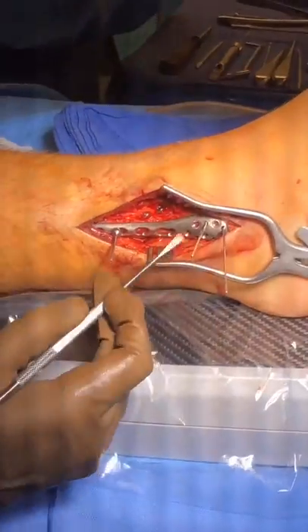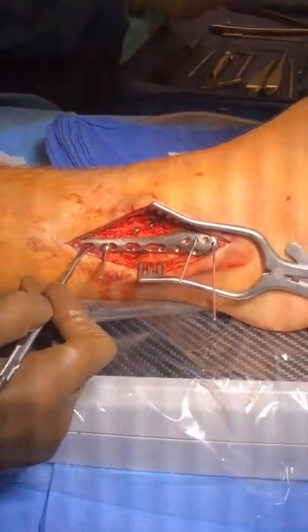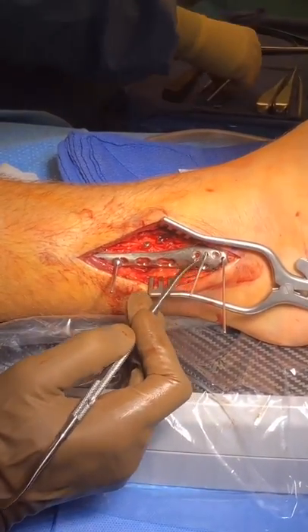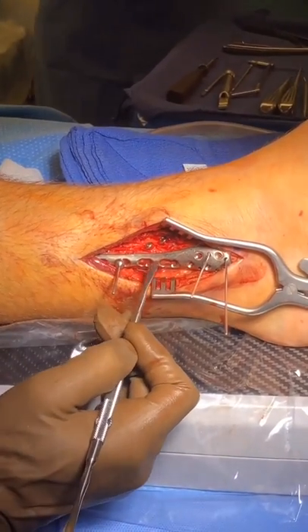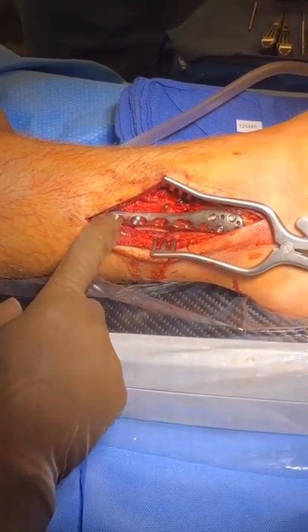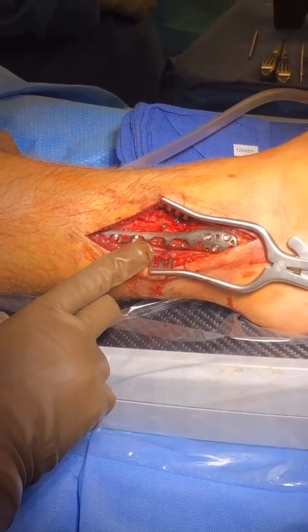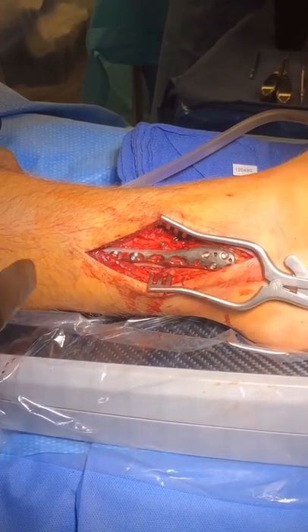Now we've put the fibular plate on and pinned it in place with a couple wires and a preliminary fixation device here. So now we'll simply place our screws distally and proximally, and then we'll place our syndesmosis fixation. Okay, now we've completed our fibular fixation here, and this is anatomically reduced, and now we will place our syndesmotic fixation.